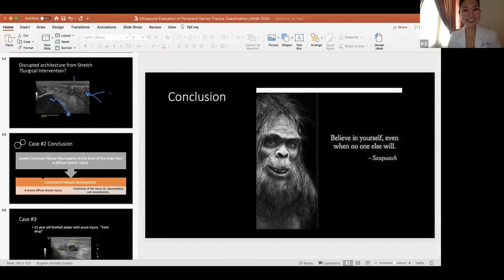Okay, thank you so much. Professor, a small question on the course of the nerve that you track down. I was wondering if this tracking is more proximal. Usually distal tracking is fine, but do you also do the proximal tracking all the way? Maybe sometimes, like you mentioned the dorsal scapular, do you go all the way to the foramen? Sure, so I do. What I decide I'm going to do when I scan is an extension of my history and physical and what I need to rule out, okay?